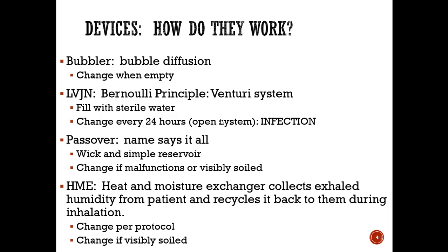The HME works very similar to that. It's got almost like a sponge-like looking material. It's going to collect your exhaled air. It's going to trap that moisture. It's going to trap that heat. And so then when you're breathing back in, it uses that to heat and humidify that air back to you.